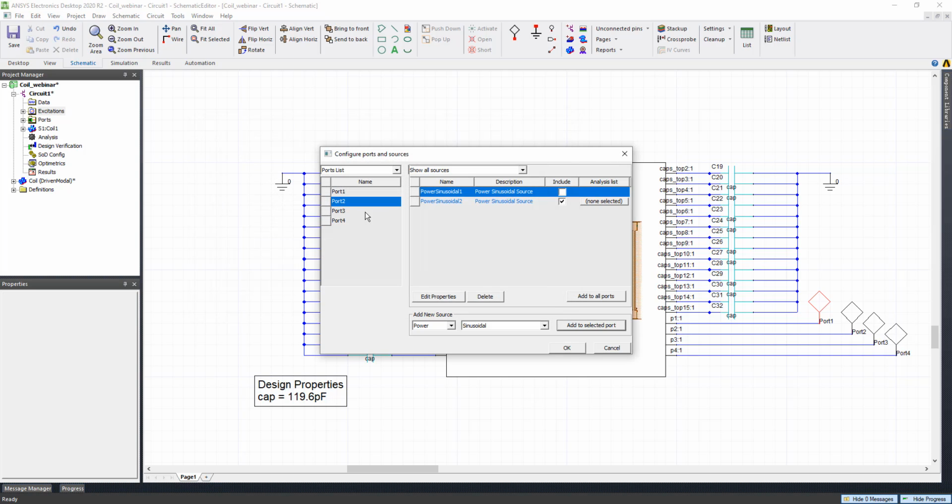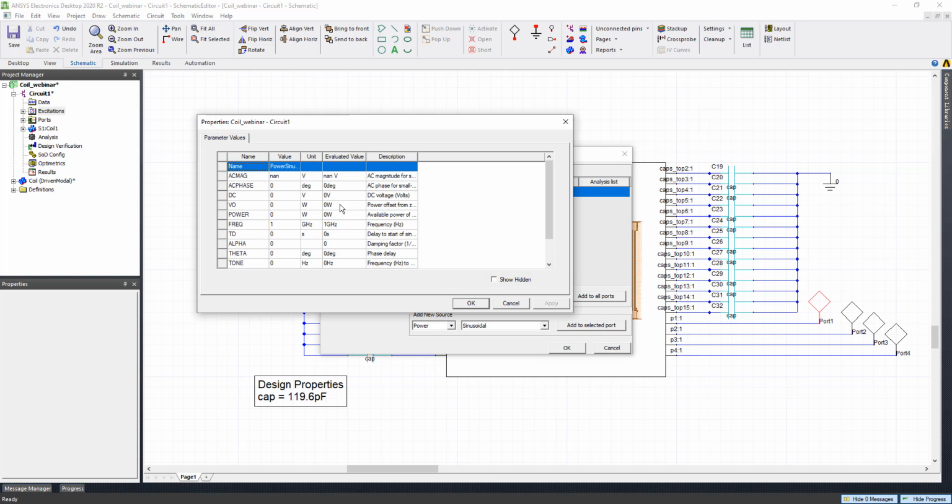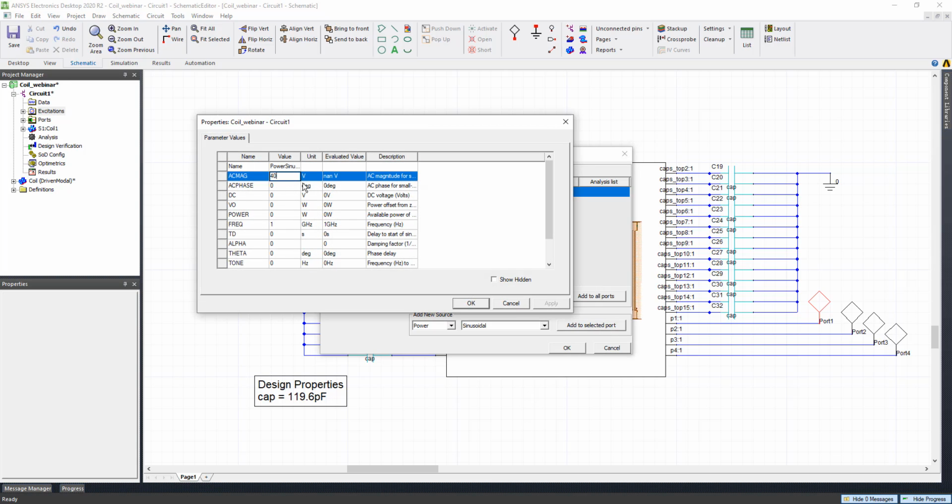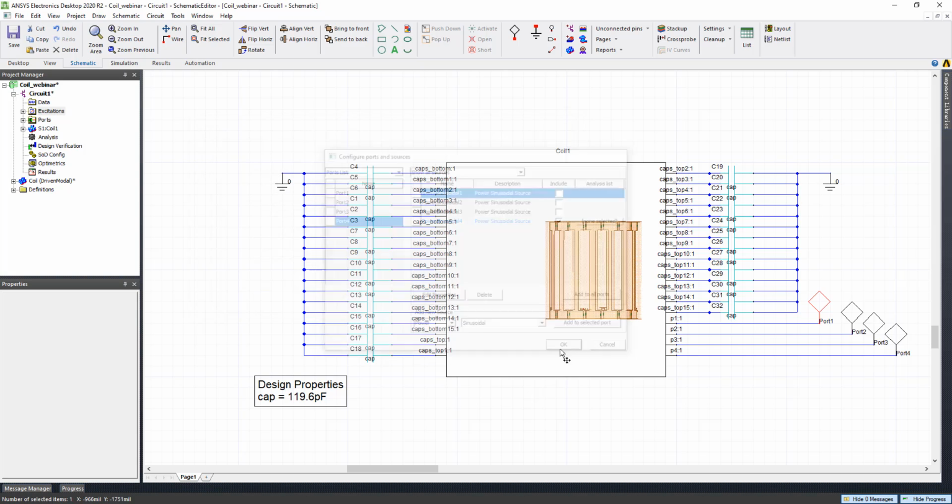Okay. Next one, 180. Alright. What's next? 270. Okay.